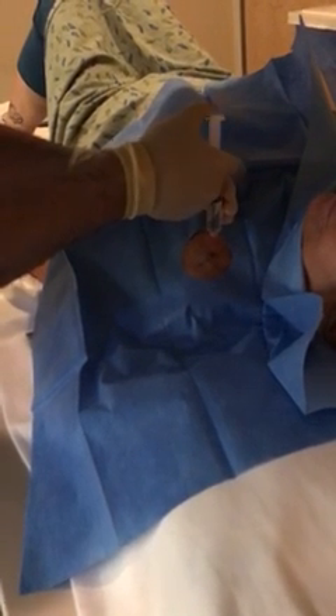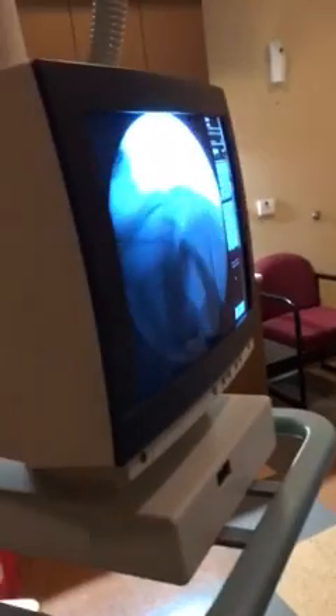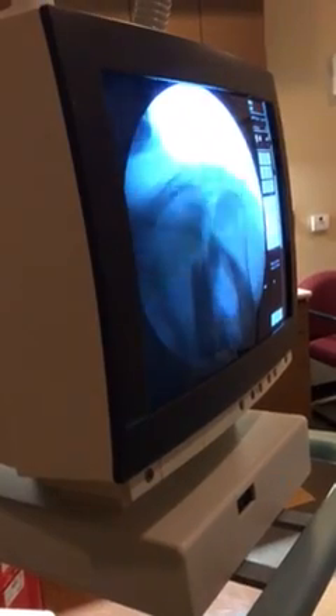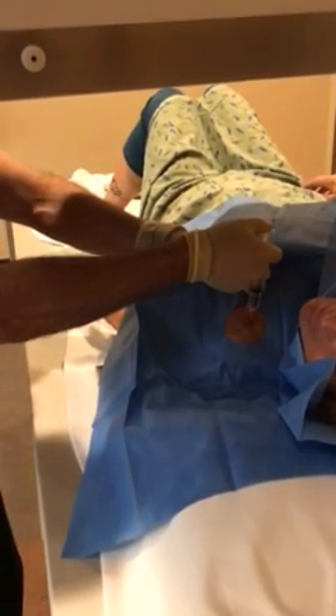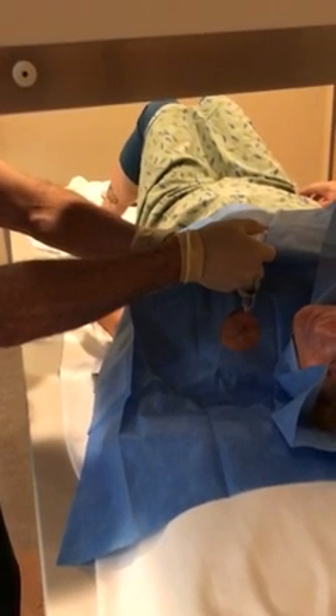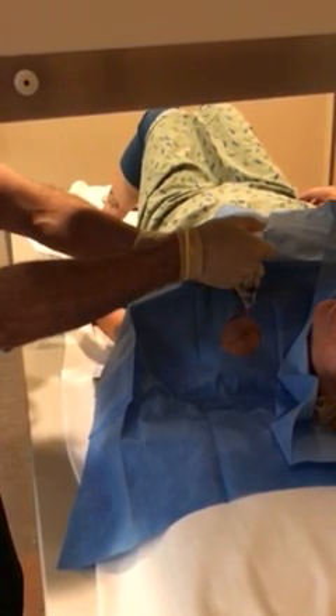We make a little wheal at the skin and then go down a little bit deeper slowly while injecting the lidocaine. When you get down a little bit deeper, you can actually check with x-ray to make sure you're headed in the right spot. My needle tip is right there at the joint space where it should be. Sometimes you're lucky enough to use the numbing needle to get down into the joint space, but most of the time you're going to need the spinal needle, which is a little bit longer.